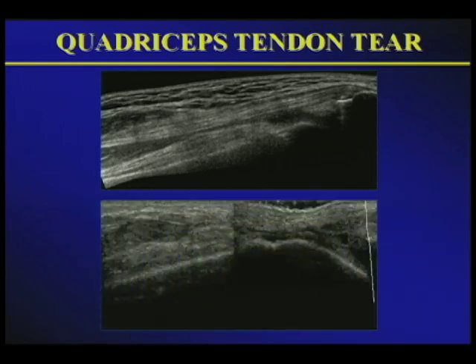But if you look at a torn quadriceps tendon, you'll notice that you no longer can appreciate that fibrillar pattern. Instead, where you have a measurable gap of a discontinuous quadriceps tendon tear, you could see that there is a herniation of the skin into that gap. This is actually more like a clinical sign that the clinicians would appreciate in the ER.